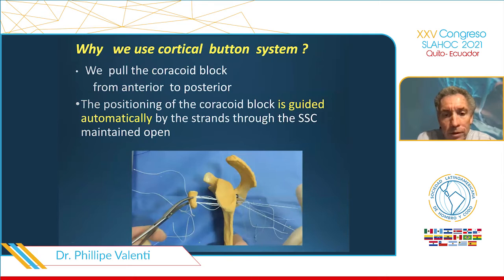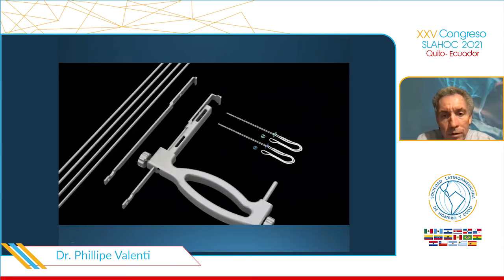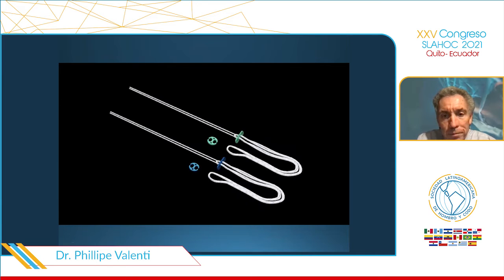It's very interesting to understand that the endo-button is a guide: automatically, when you pull the strands, it puts the coracoid process in front of the glenoid rim. This is a small video of the system with a guide with 2 endo-buttons.